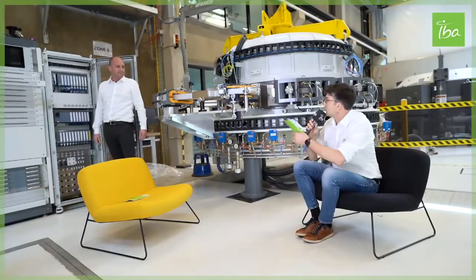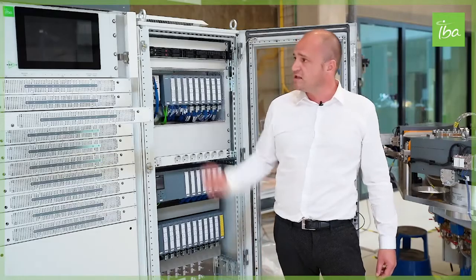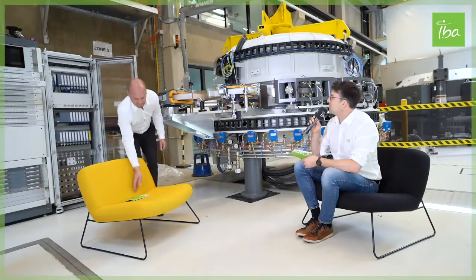I've seen that there are thousands of parameters that we can control, the temperature of the modules, etc. This is really what we have with the solid state, that everything is accessible remotely, actually. No? Yes, exactly. We can display all the information on the interfaces. Excellent. So I invite you to come back and to tell us more about the safety system. Okay.